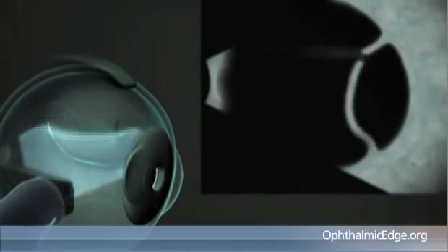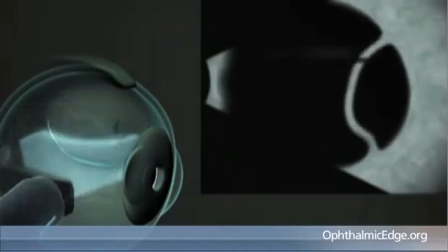For example, diabetic traction retinal detachments. They often involve some areas and leave other areas completely normal, ultrasonically at least. And yet you want to be able to draw a complete retinal drawing of the interior of an eye, especially when it involves the area close to the macula. So I use all clear media cases for teaching, and I ultrasound as many patients as I can so that I can look inside and judge my quality of three-dimensional thinking constantly.